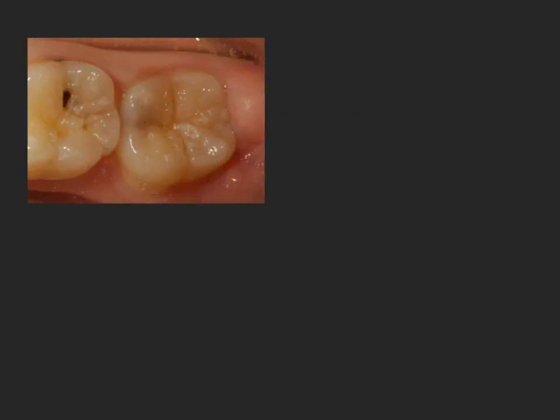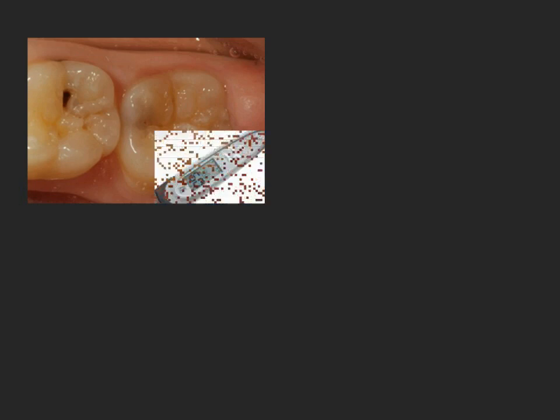So here we have a clinical case. What do we see on the second molar? Maybe a little bit of darkness, no stick. We see a definite area that can stick with an explorer in the lingual groove on the first molar, verified with Diagnodent. In the second molar, that tooth needs to be treated.